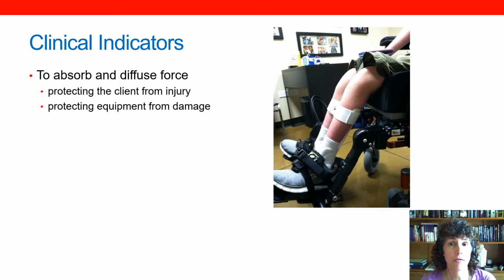So this is part of a series of brief videos discussing clinical indicators for dynamic seating. And one of our primary clinical indicators is to diffuse this force. This protects the client from injury and protects the equipment from damage. And we'll be discussing each of those topics in subsequent videos in more detail. But let's talk for a minute about how dynamic seating actually absorbs and diffuses forces.